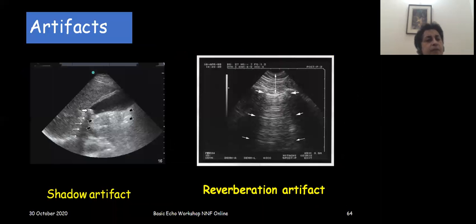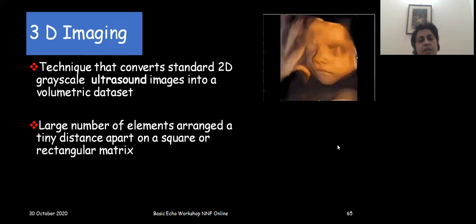For example, this is an abdominal ultrasound. This is a gallbladder. There is a stone at the end of the gallbladder, and because everything is reflected here, at the back of it I can't see anything. So it appears as a shadow. It appears probably that it's a cystic lesion there, but this is only a shadow artifact. And artifacts are also used extensively, now in lung ultrasound. So here is an image. This is the pleura, and that is seen in all the images below.